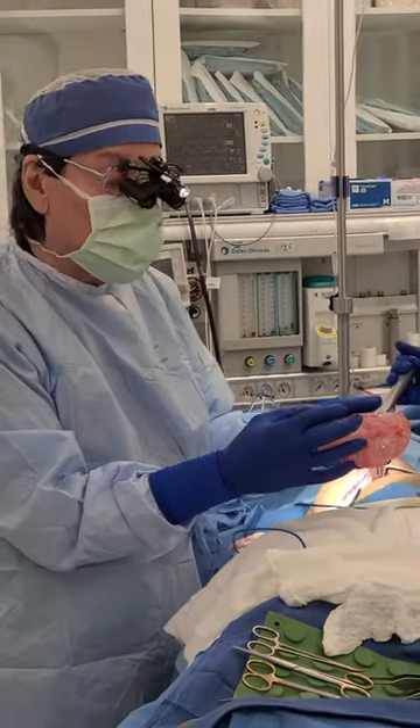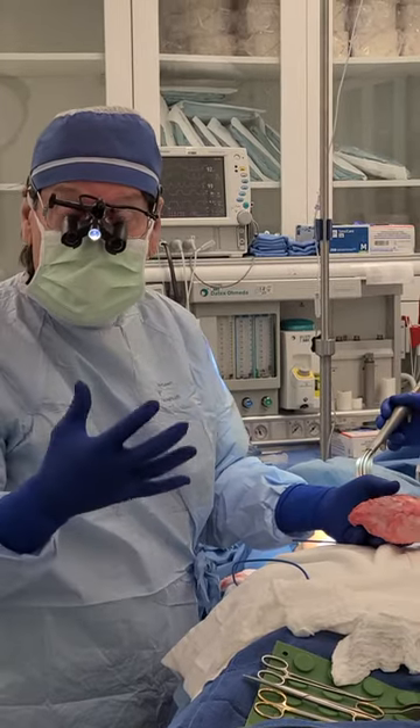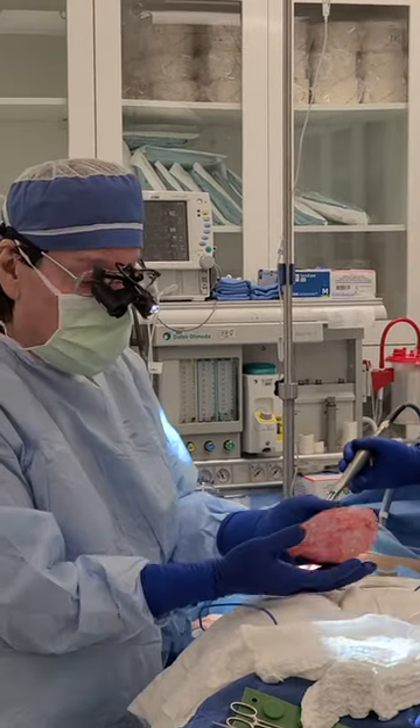This happens not only with breast implants, but with pacemakers, pain pumps, or joints. Anything that's a foreign body that we implant into the body is covered by a capsule.